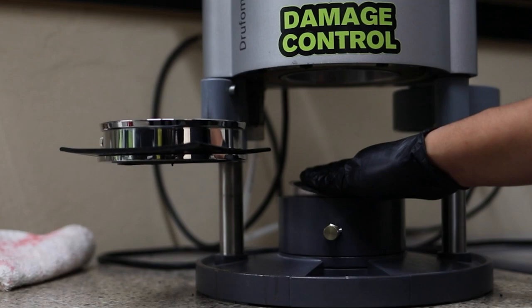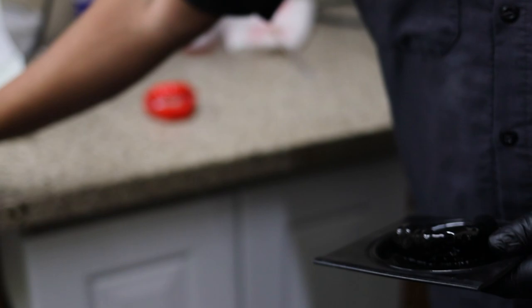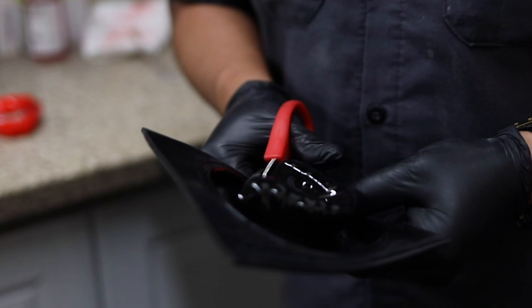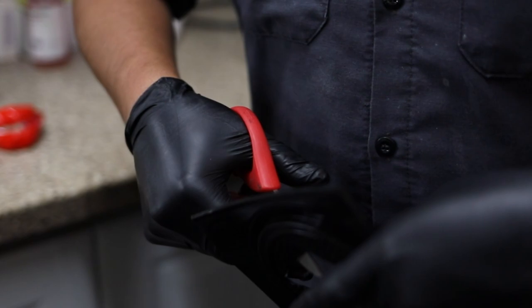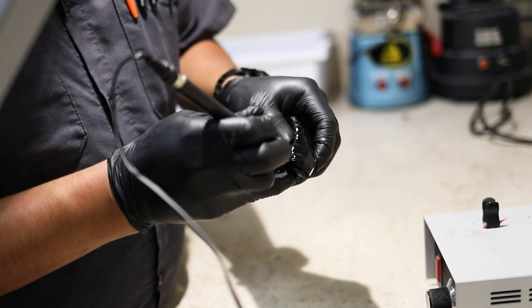And as Vic shows you this mouth guard, this is the mouth guard we're gonna add text to. And he usually gets this mouth guard, which is a Bible verse, Philippians 4:13. And he has the tattoo of this Bible verse on his chest. And so right now Vic is just cutting off the excess with the heat knife.